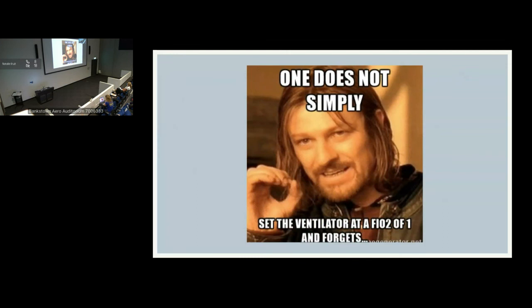All you've done is you've lost native ventilation, so you've increased the pre-existing pulmonary shunt that was occurring. Eventually, their PO2 will come up, but we're just trying to keep them safe at the moment and rest the lungs. So aiming for a PaO2 of 50 or 60 is perfectly reasonable in the early stages. And you want to wean the FiO2 on the ventilator as much as you can.